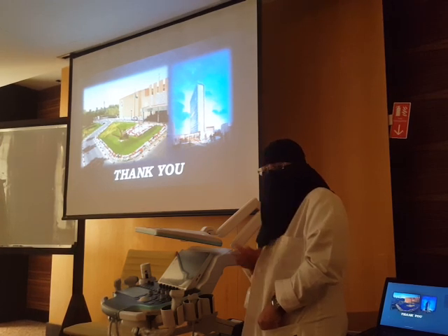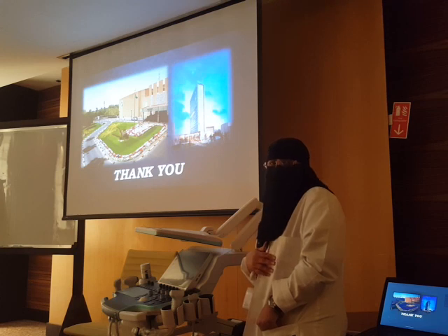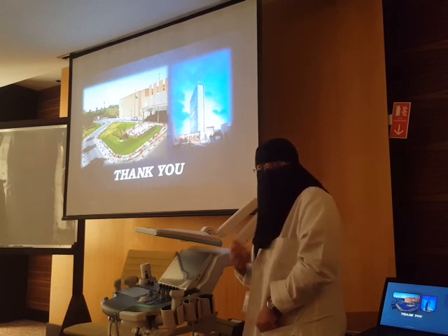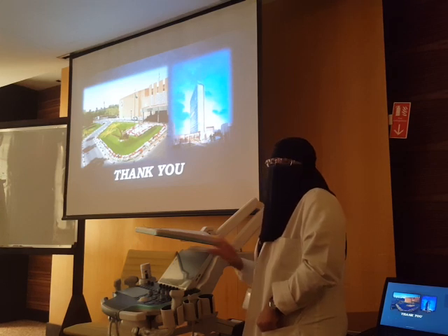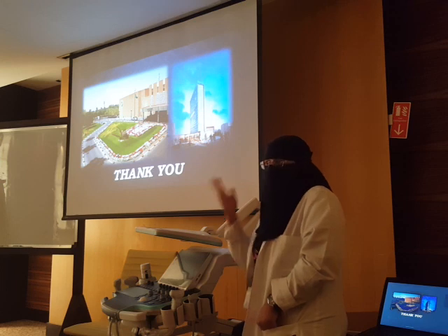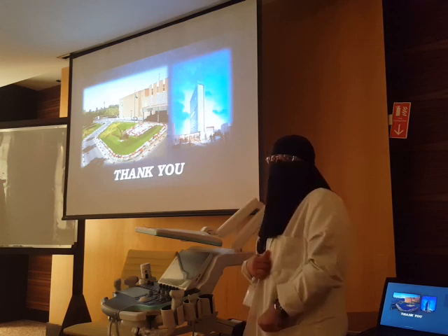The most commonly requested examination for bowel is appendicitis. Appendicitis is the most common. زي ما قلت, the intussusception, it's common but not that frequent, لأنه sometimes it's just transient and we cannot catch it by ultrasound. They can just do fluoroscopy.